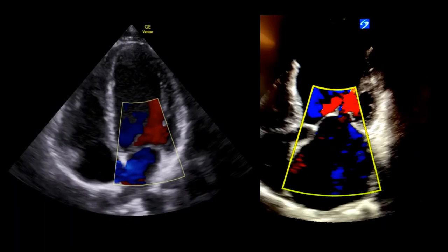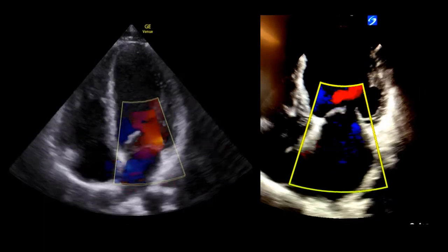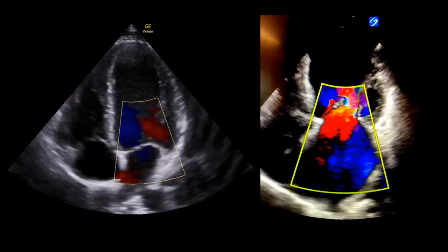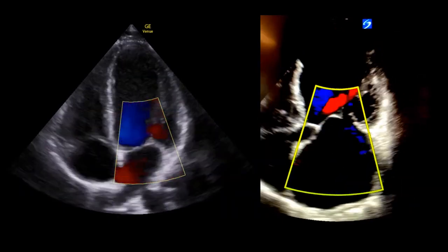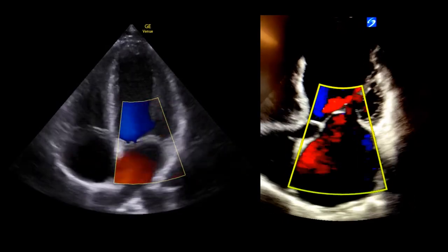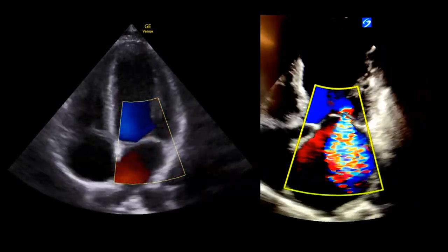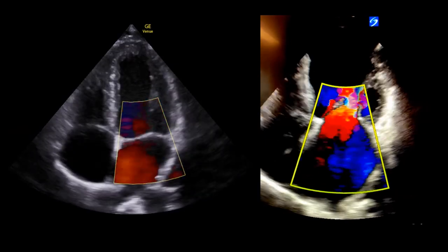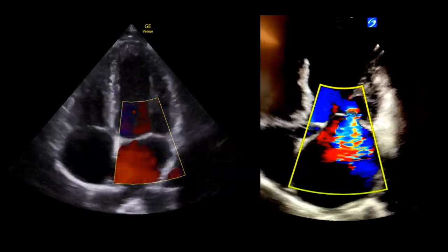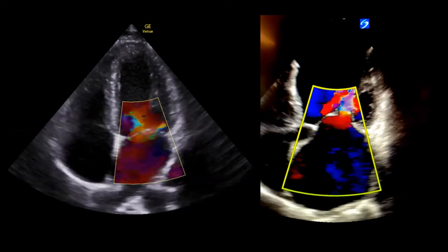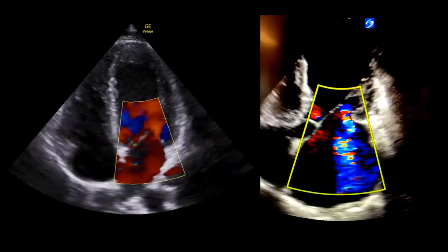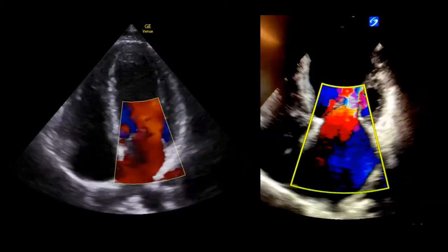Here we compare, on the left, the same heart from the previous slide — which, by the way, is my heart — with the heart on the right, which has severe mitral regurgitation. On the right, you can see a whole jet of blue blood flow across the mitral valve, which, by being blue, means it is moving away from the probe — that is, coming from the left ventricle into the left atrium. This is serious regurgitation.